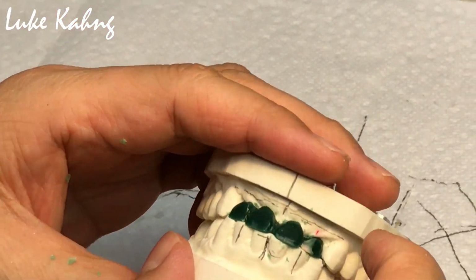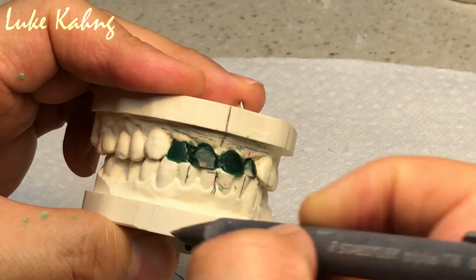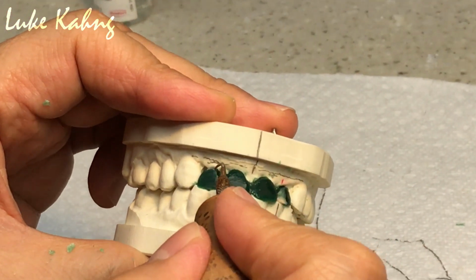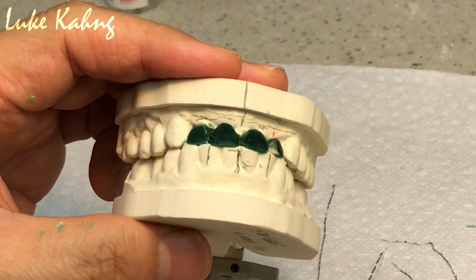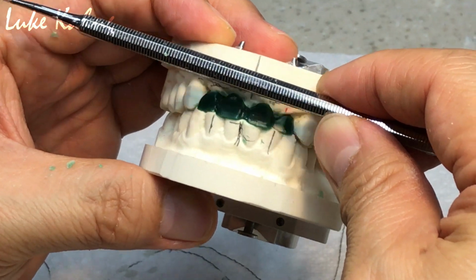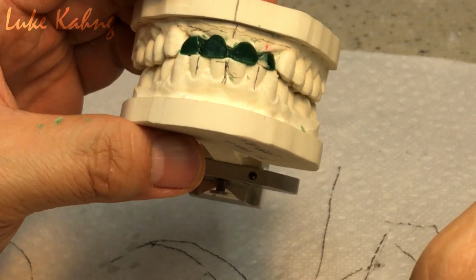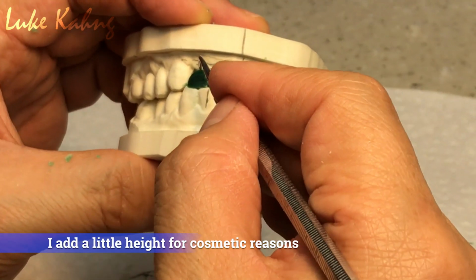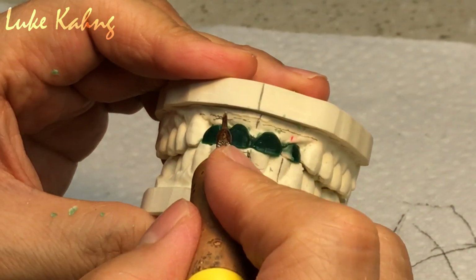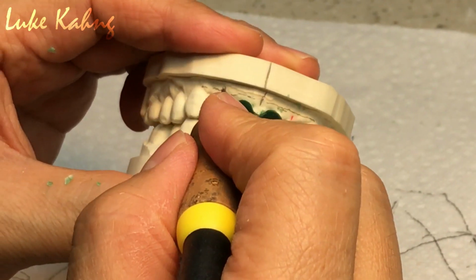Okay, now here's a dilemma. You can add a little bit more because this is my final. Okay, just a little bit, tiny bit. We will be overlapping. I call it controversy. Whenever they're smiling, some people don't like it to show, but hygiene-wise, it's terrible. But cosmetic-wise, I have to add a little bit, just a little bit for them. For the aesthetic, because this is anterior. Whenever they're smiling, I don't want them to be embarrassed. Right?